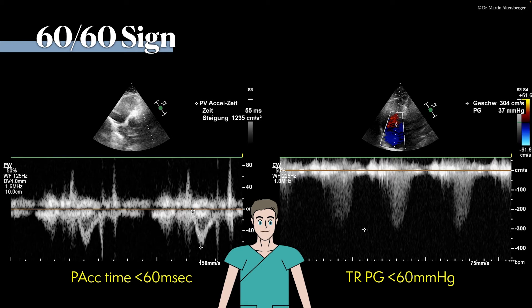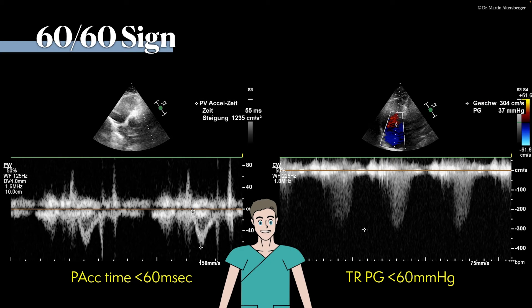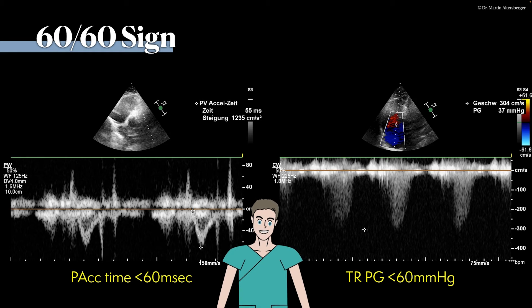A pulmonary acceleration time below 60 milliseconds shows a very high likelihood that pulmonary hypertension is present — in this case an acute form due to pulmonary embolism. The second measurement is the continuous wave Doppler across the tricuspid valve, where we see tricuspid regurgitation and a degree of pulmonary hypertension. For the 60-60 sign, the TR pressure gradient should be below 60 mmHg. In pulmonary embolism it very often doesn't reach 60 mmHg — typically in the range of 40-45 mmHg.